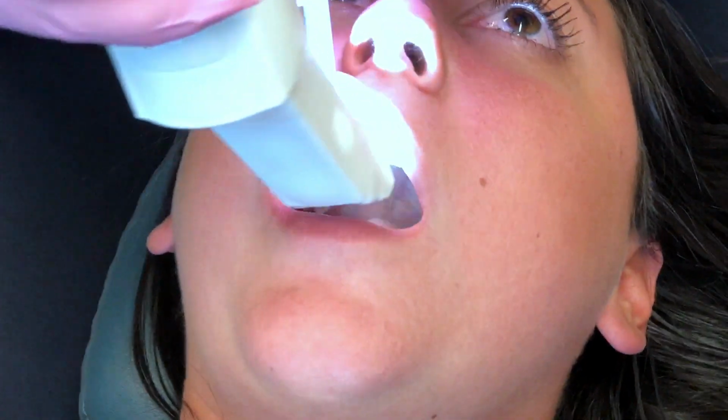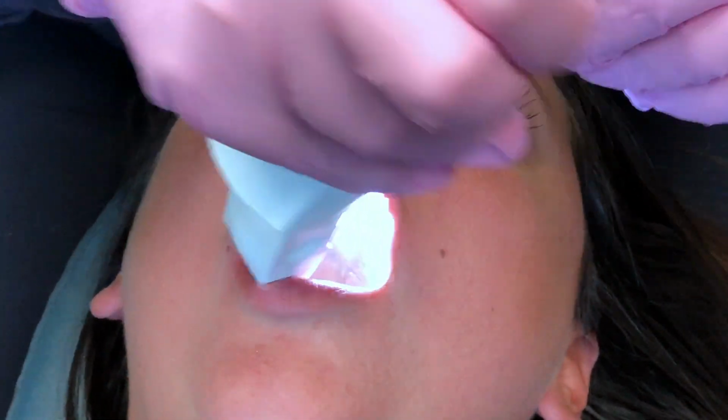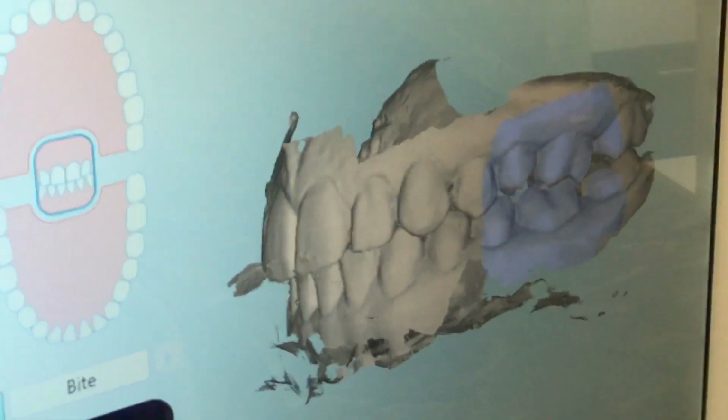I rest the tip on the ScanMate and I let the ScanMate almost guide me to where I want to go. And then I'm getting that full retraction. If you get the retraction from just the scanner, that's when you get the lip in the picture. But with the ScanMate, there's no lip. Bite down all the way. Again, I'm resting this on here. I can get full retraction to the molar. So see how quickly the scan drops in?